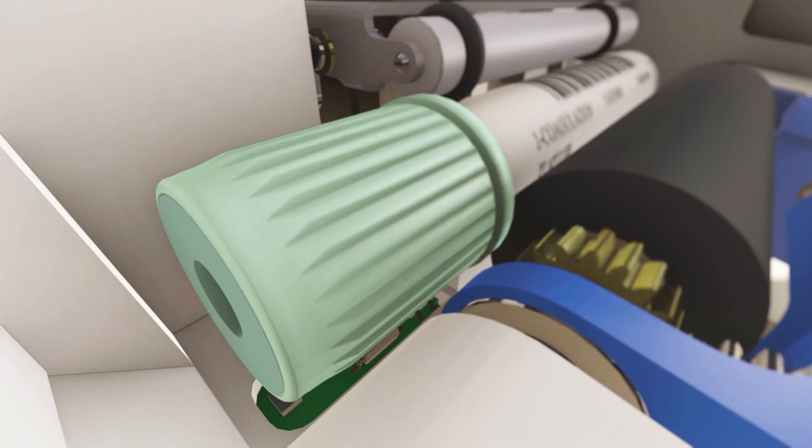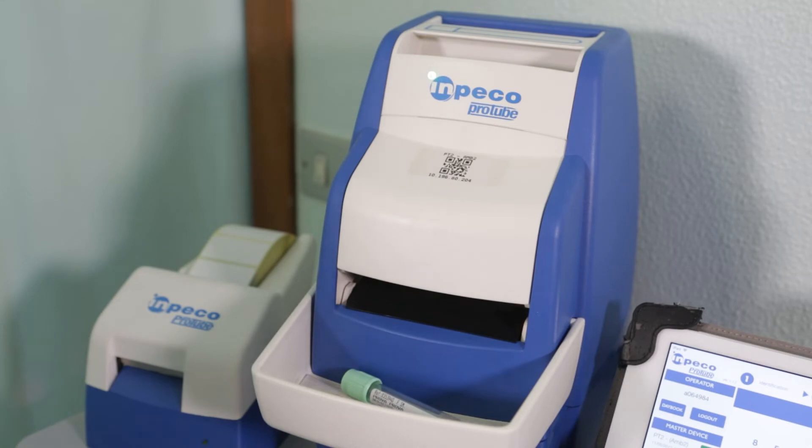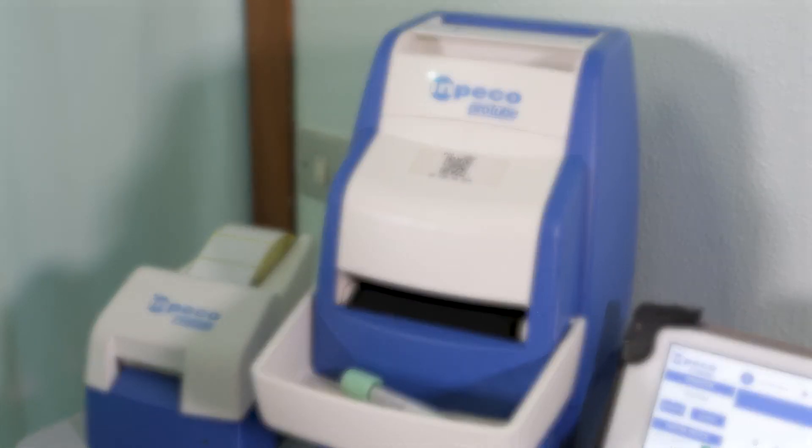The tubes are automatically labeled in front of the patient to avoid the wrong blood in tube errors that may lead to catastrophic outcomes.